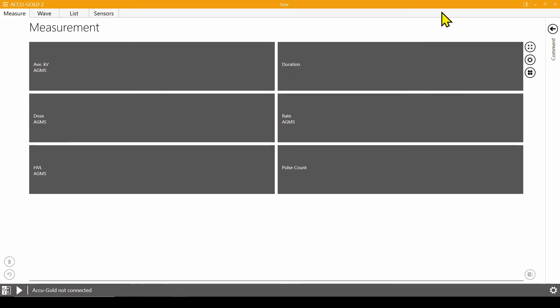You can activate companion mode using the toggle switch located in the upper right corner of the window. Excel will automatically open alongside AccuGOLD 2.